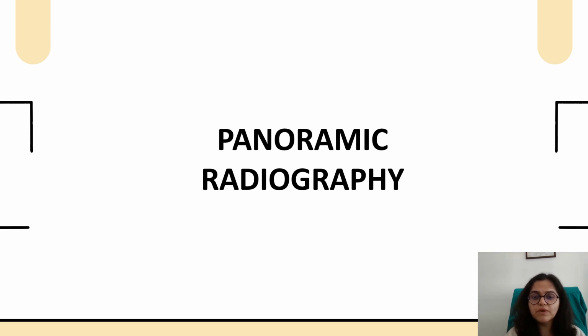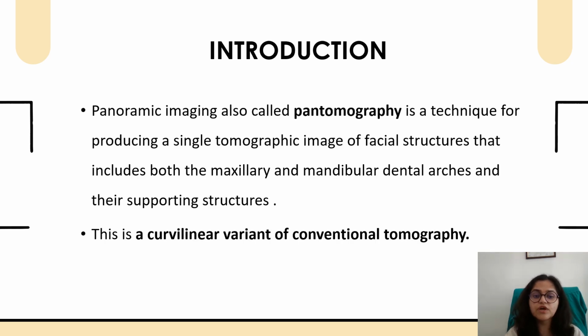Next is panoramic radiography. Introduction: if we talk about the panoramic, which is also known as OPG, panoramic imaging, also called pantomography, is the technique for producing a single tomographic image of the facial structures that includes both the maxillary and mandibular dental arches and their supporting structures. This is a curvilinear variant of conventional tomography.